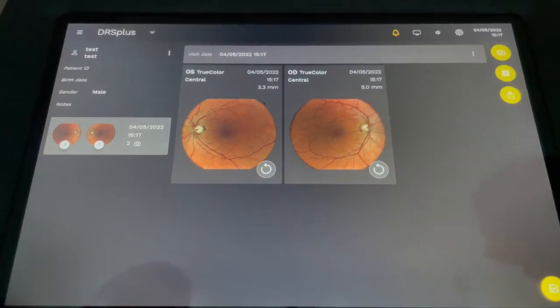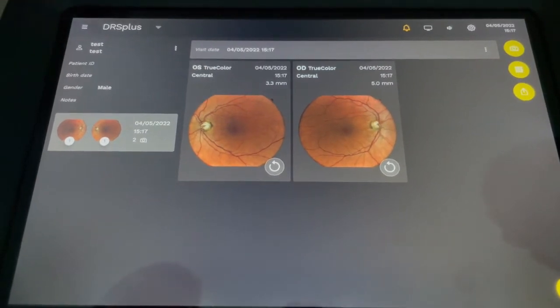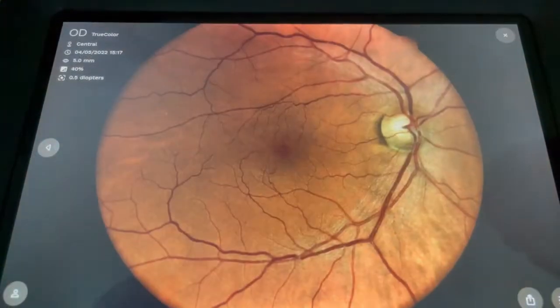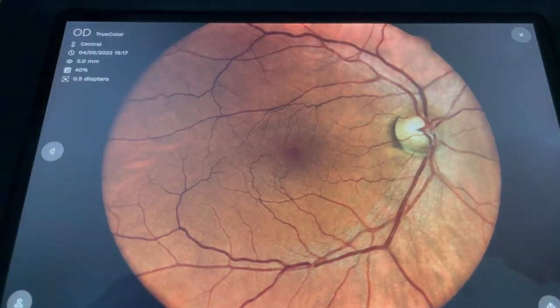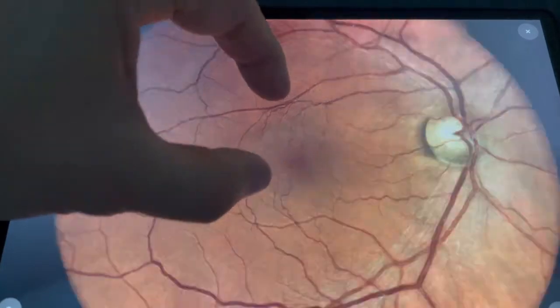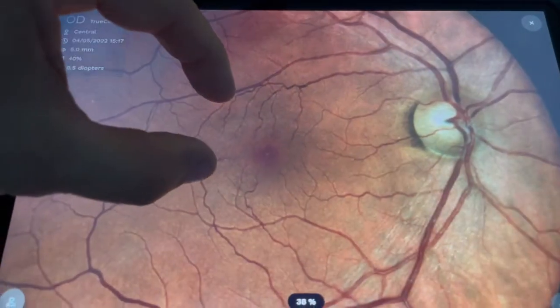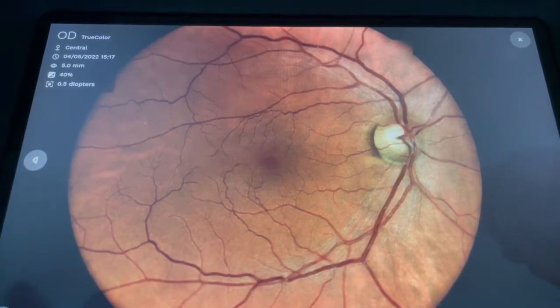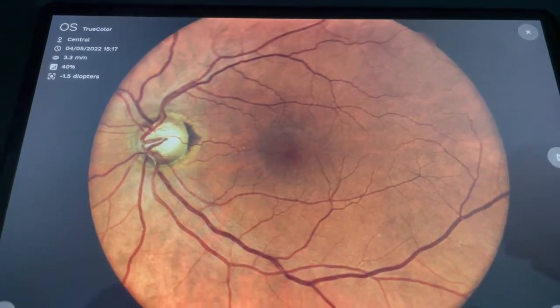These are the two fundus images that we've just taken — the left eye and the right eye. To view these, we can click on either left or right, and it gives you a large image of the fundus. We can magnify that. And if you want to then skip to the other one, we can skip, and then we'll do the other eye.